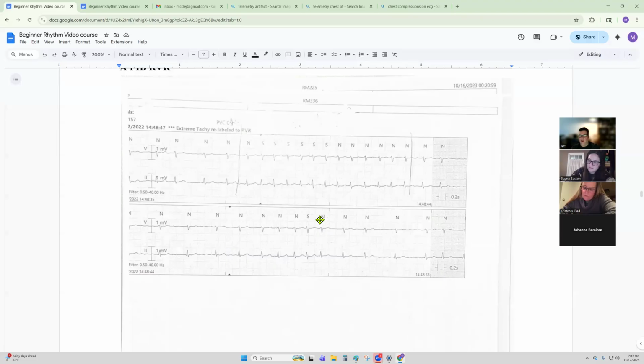My opinion on RVR is, first of all, when you convert to AFib, you're going to be fast and uncontrolled. Anything over 100 is going to be considered uncontrolled. And because the atrial chamber is in a muscle spasm, and that spasm can be up to 800 beats per minute, it's going to be fast. The responding RR is going to be fast. You'll see people convert to AFib, and they'll just see 130s, 140s, and that's who they are.